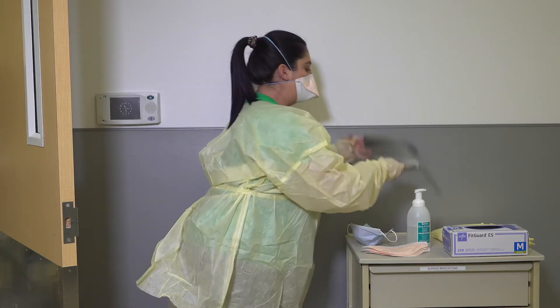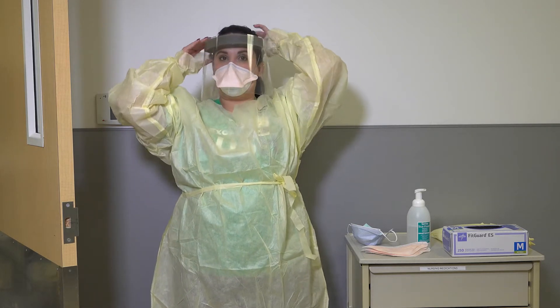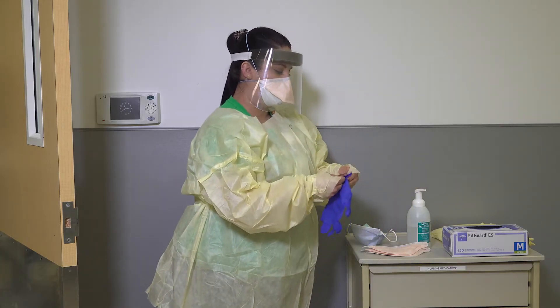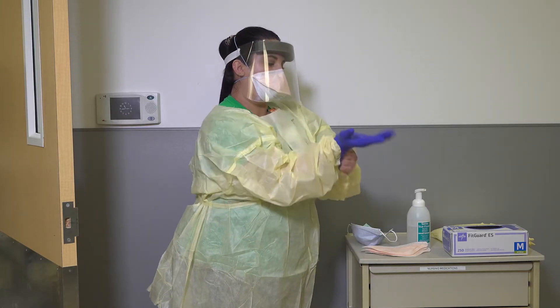Place your face shield or goggles over your face and eyes. Adjust as needed for proper fit. Don your gloves, ensuring that your gloves extend to cover the wrists of your isolation gown.